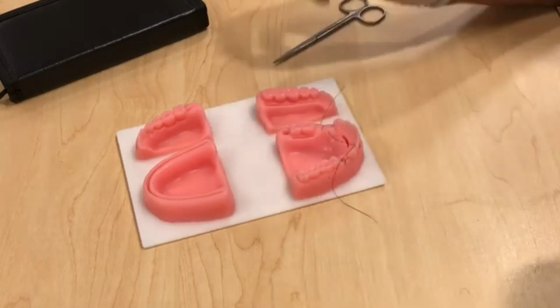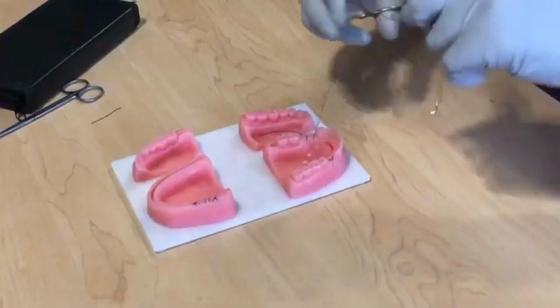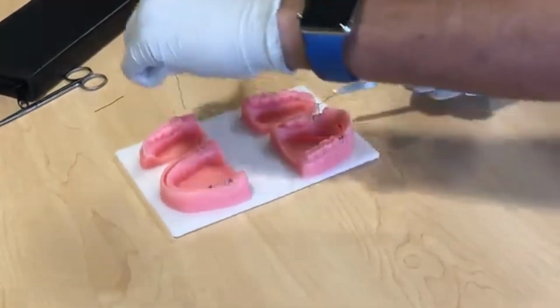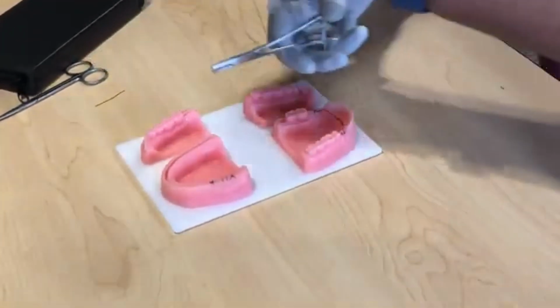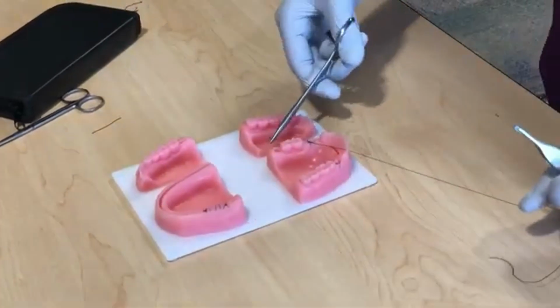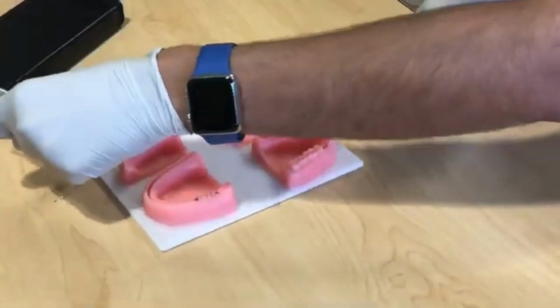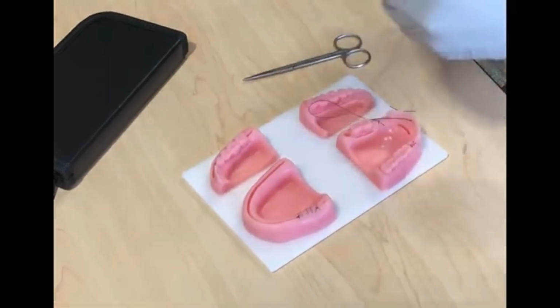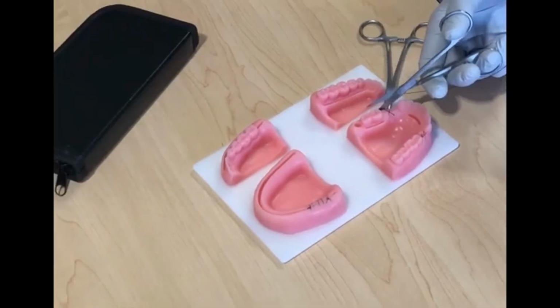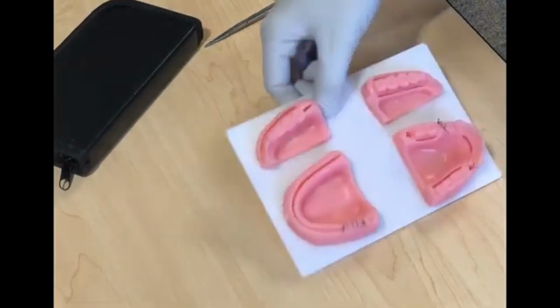Okay, and now just like what we did for the simple interrupted, we're gonna do 2 loops toward the short end, and then go and grab it, and then pull across, just like that. And then you do a single loop toward the short end, pull across. Okay, and then you do 1 last loop toward the short end, and then you're gonna pull across. And then there you have it. Just cut it. And there you have it. That's why it's called figure 8, because it kind of looks like an 8.